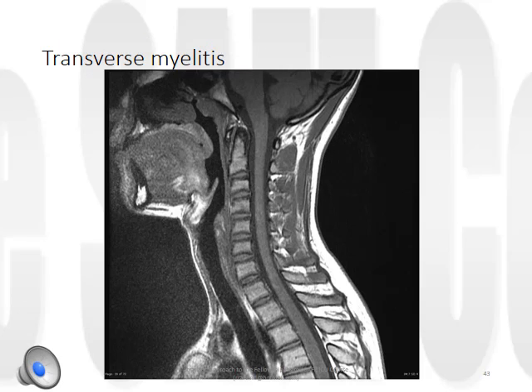So it's important to think for the exam broadly about the types of pathologies you see in ICU and understand the imaging for those pathologies. So if we consider transverse myelitis, up to 40% actually have no findings on MRI, and in the remainder the appearance is variable and non-specific. There's a large variation in the lesion size, but they most commonly extend for 3 or 4 spinal segments and occupy greater than 2/3 of the cross-sectional area of the cord.